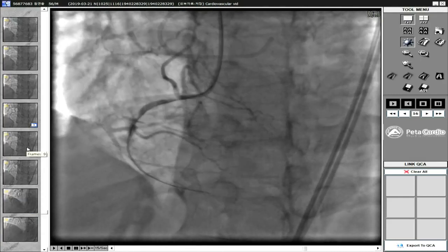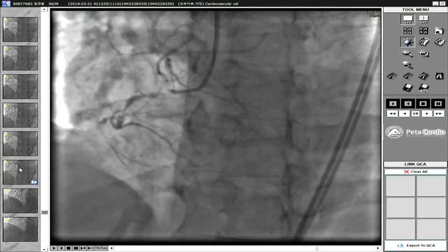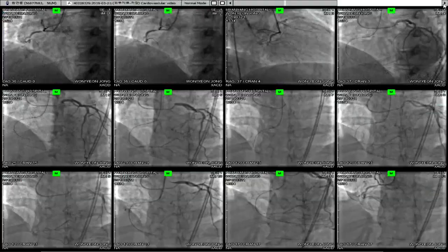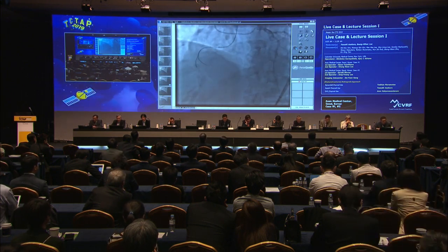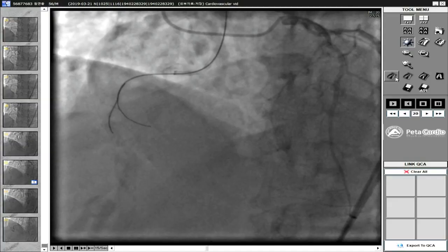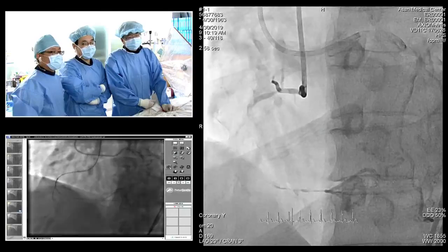Next. Could you show the wiring? Maybe previous. Yeah. Previous. Two wires were attempted. Then suddenly we don't know, but there is a lot of. So anyway, the problems. The previous attempt was an antegrade approach. I think maybe the procedure time was so long, this kind of situation. Maybe the previous attempt reached the distal region. However, I don't know what was going on at that time. So this is maybe the most good thing to succeed.